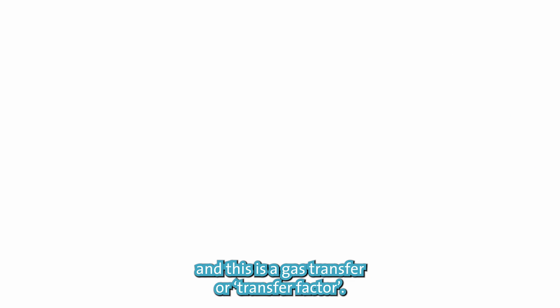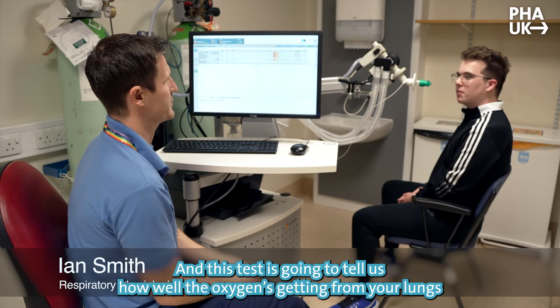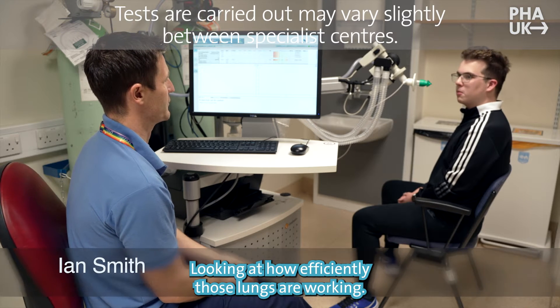Okay Adam, so we're going to move on to the next test and this is gas transfer, or transfer factor. This test is going to tell us how well the oxygen is getting from your lungs into your blood — to look at how efficient those lungs are working.